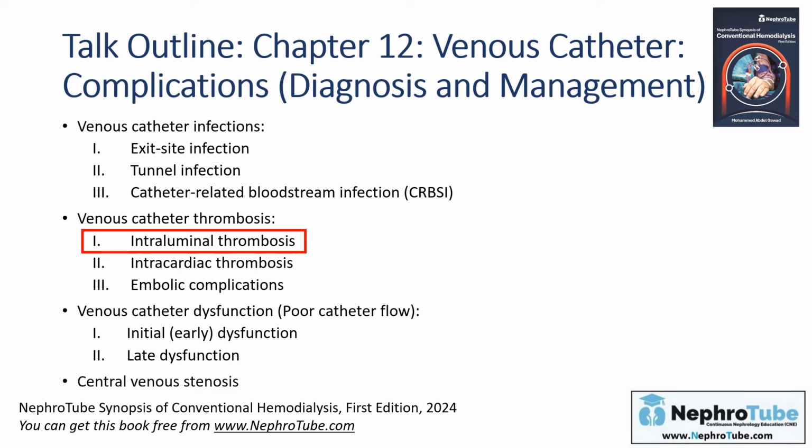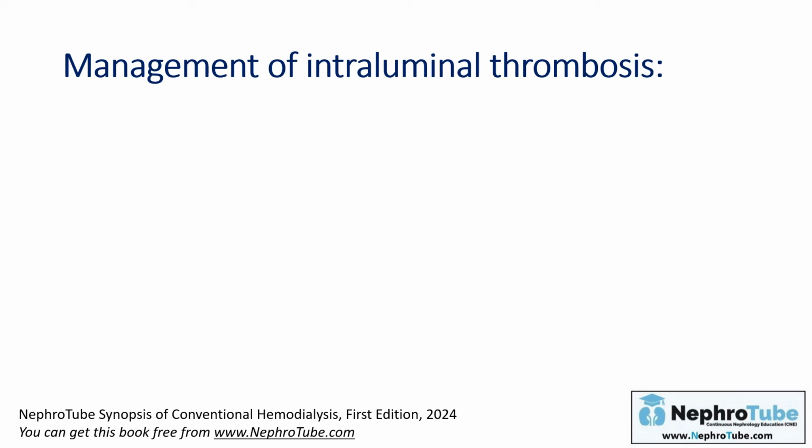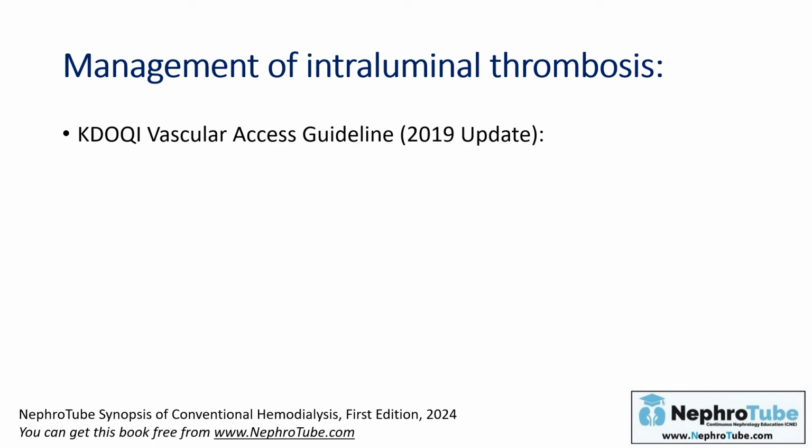Regarding intraluminal thrombosis, you will find the catheter is blocked. You cannot push saline in it, and you cannot aspirate blood from it. How to manage intraluminal thrombosis? According to the KDOQI 2019 update, they recommended alteplase or urokinase plus citrate for restoring blood flow in occluded catheters.